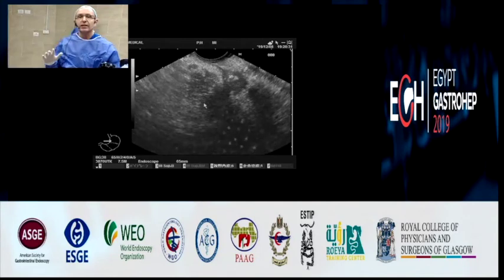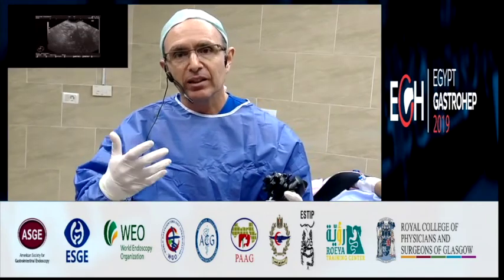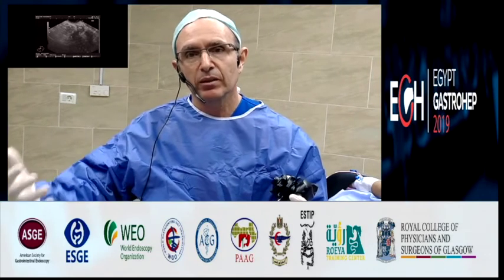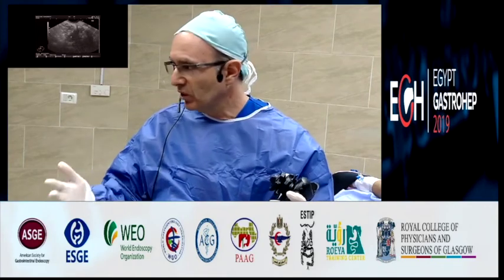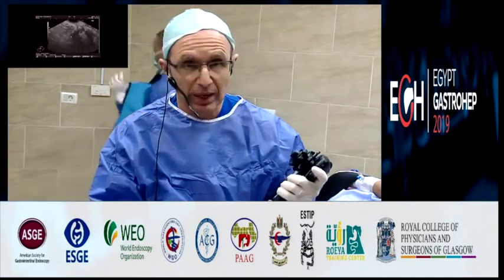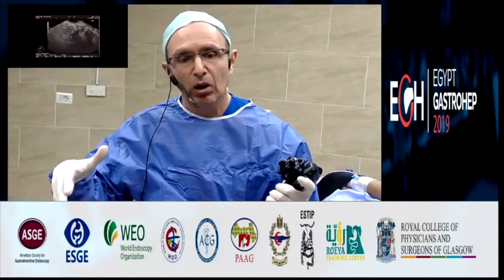And I would say that it's very important to talk to the pathologist while you're doing this procedure. So you ask him or her how he wants you to condition the material. You take the specimen, and what does he or she want you to do with it? Part on the slide, part of the specimen in the bottle? With my pathologist, I put everything in a bottle of formaldehyde, and the pathologist processes it like a cell block.